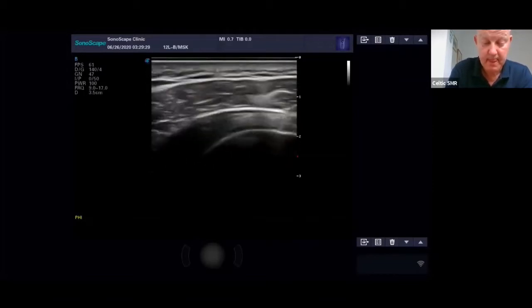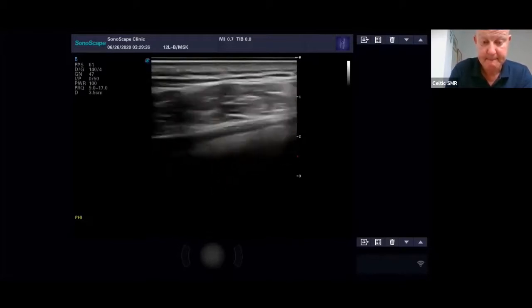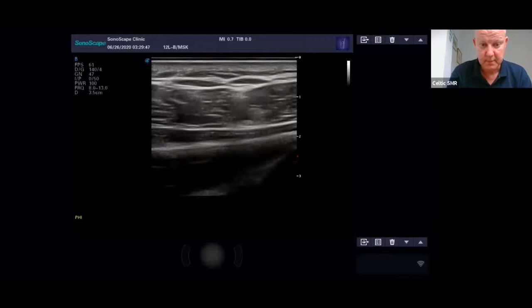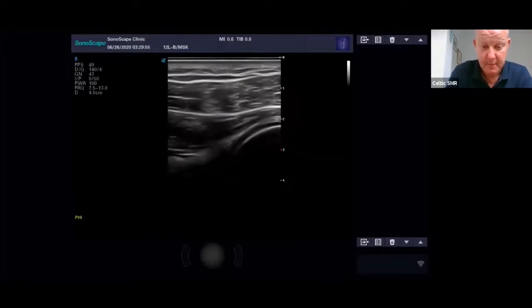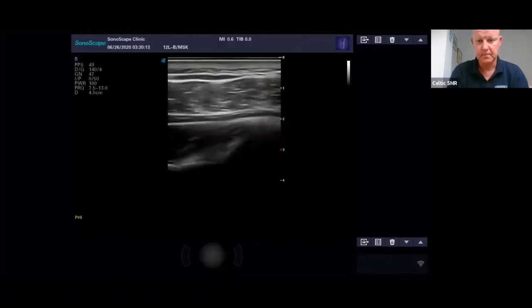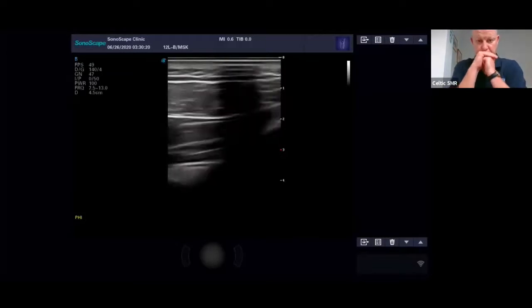Okay. Now, obviously, I'll just go over, because this is in the area of the infraspinatus, the glenohumeral joint, which is at the back here. For that, it's a little bit deeper, so I'm going to take the frequency down a little bit and maybe increase the depth. Oops, wrong way. And then I can go down into here. So I've got the glenoid here and the labrum here. Labrum, back of the joint here, so you look for any effusion here. And teres minor will be down here. We don't see much injury in teres minor, but that would be a little bit lower, which is here.